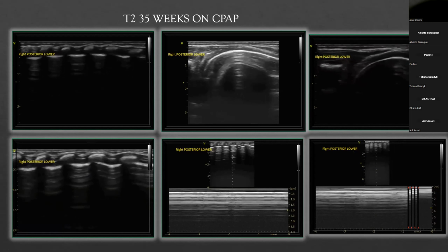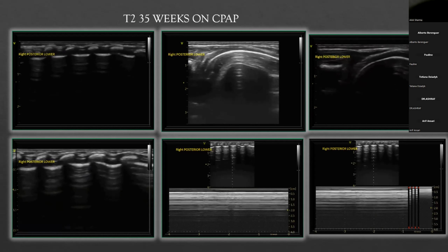I'm just giving you tips. You could make the baby cry a little bit, gently. In situations like this, if the baby's stable, I wouldn't want to do that if you've got a very big pneumothorax because it might make the baby worse. But if it's confusing, you can tickle the baby's foot, anything that makes the baby breathe a little bit faster to make the sliding more prominent. So, small things that can help you in that situation.